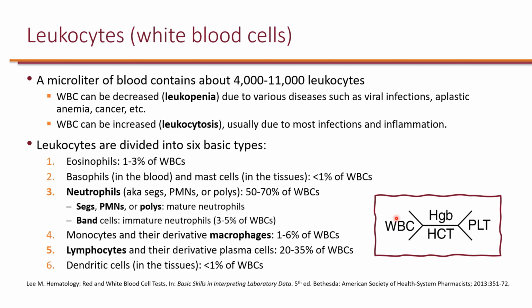And typically, if somebody says white blood cell is 4, they really mean 4,000. They're not going to write 4,000 or 5,000. So they typically write, like, 6.2 or 13. If somebody writes 13 here, they really mean 13,000. Now, if you know somebody has leukopenia and they write 50 here, they're really talking about 50 cells. They're not going to write 0.050. So you just have to use it in context.